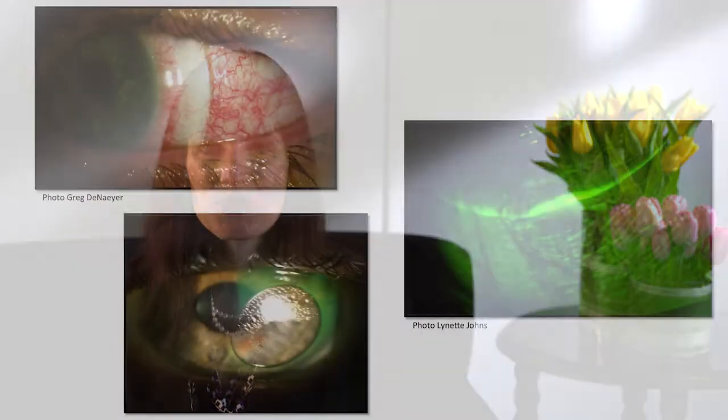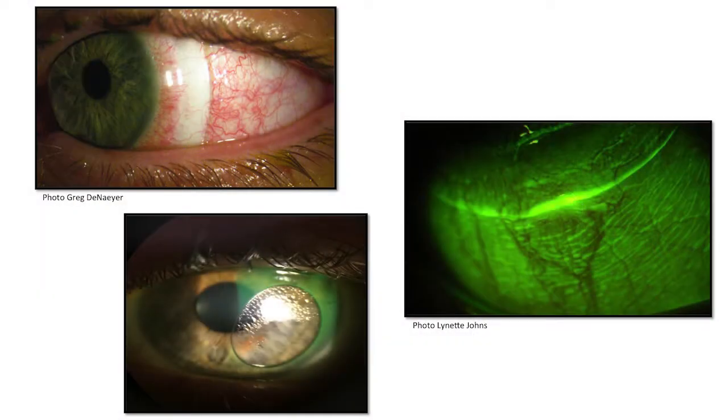You can see a picture below of a bubble, and we know that we don't want any bubbles with a scleral lens because a bubble can provide an impression on the lens.